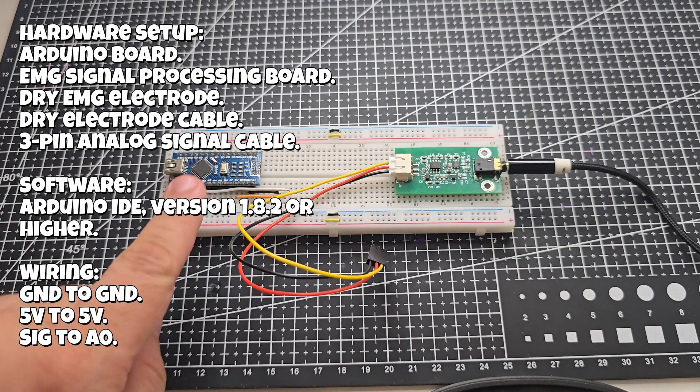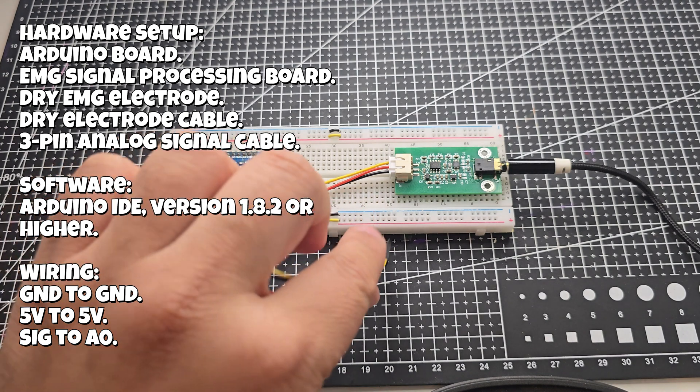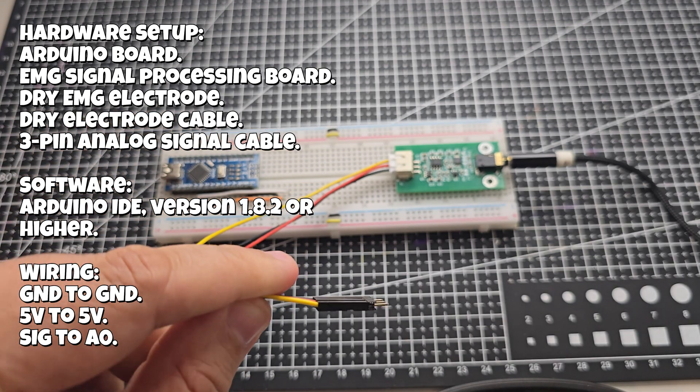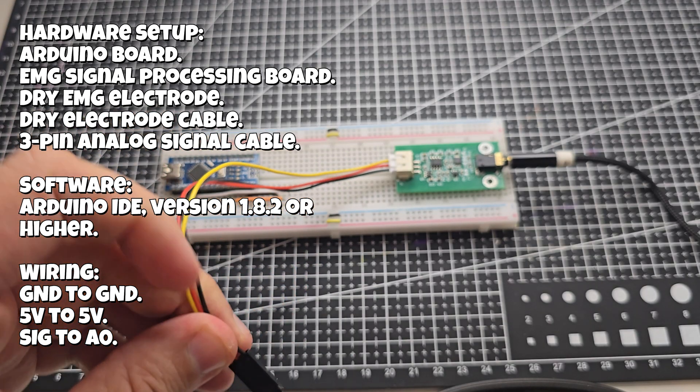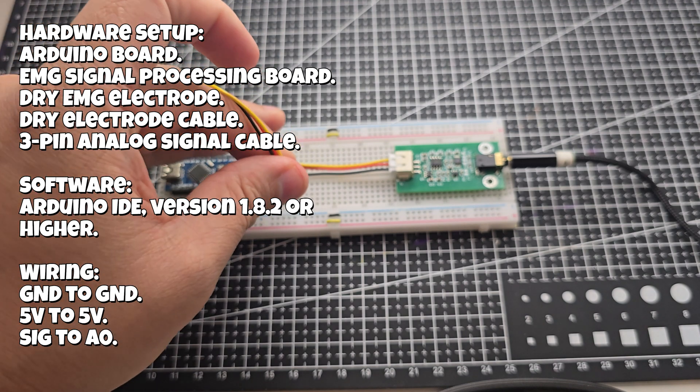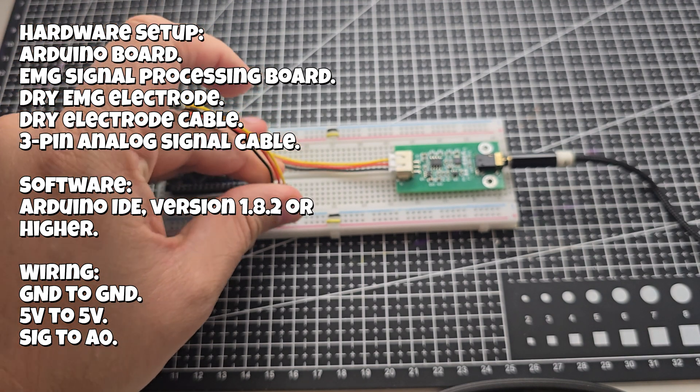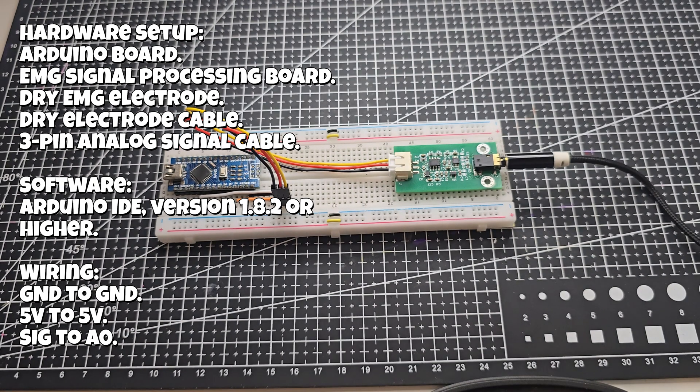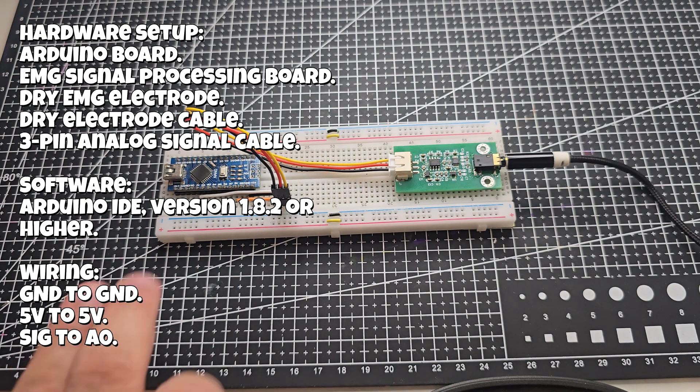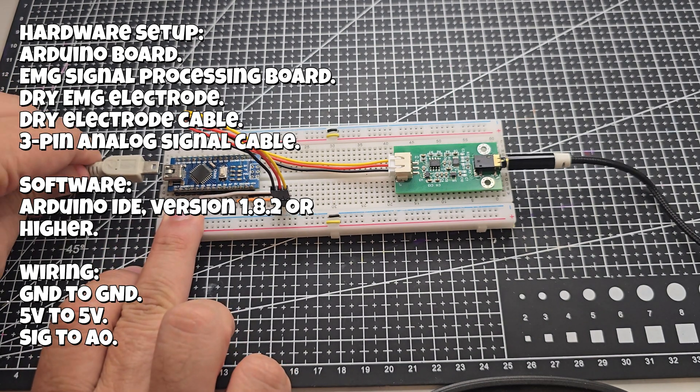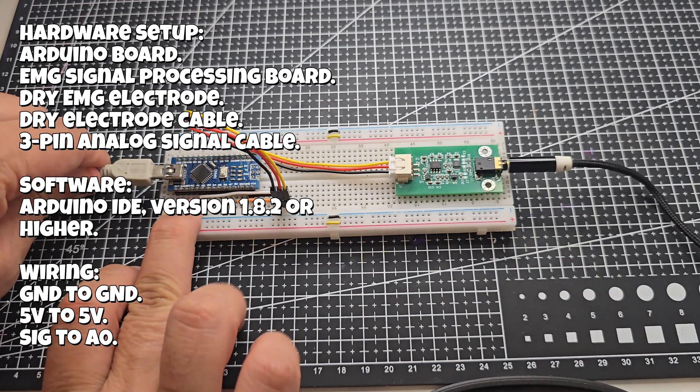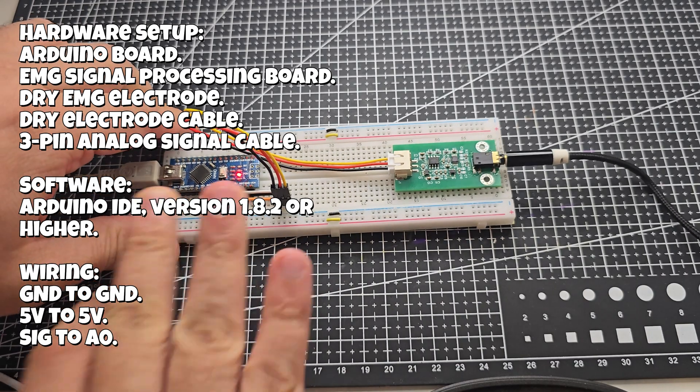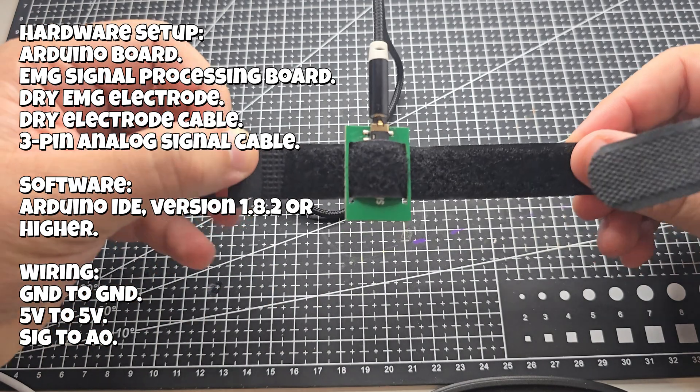Hardware setup: Arduino board, EMG signal processing board, dry EMG electrode, dry electrode cable, 3-pin analog signal cable. Software: Arduino IDE, version 1.8.2 or higher. Wiring: GND to GND, 5V to 5V, SIG to A0.